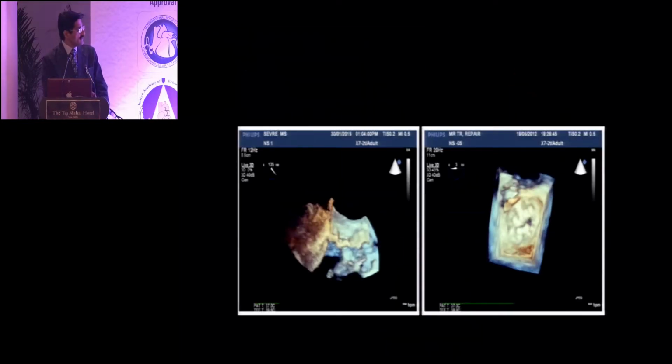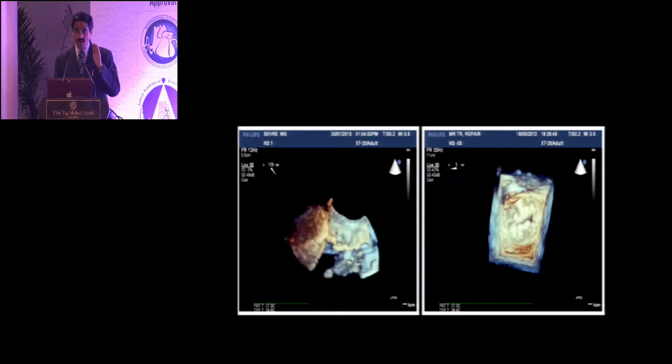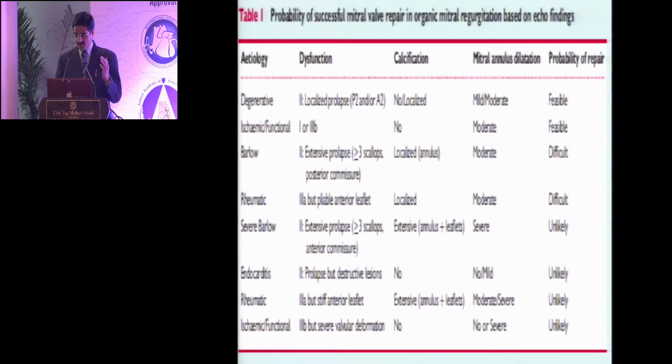Now these are very difficult mitral leaflets, where you can say significantly calcified leaflets, both leaflets are restricted, and surgeons should never think of doing repair. Even if they do delaminating of the leaflets, it is not possible. And in this case, we can even ask the surgeon that if you are doing replacement, please explain to the relatives that these patients can require a pacemaker because of the significant calcific aortomitral continuity. So this is how it can differentiate.